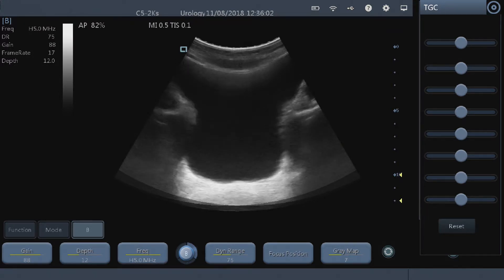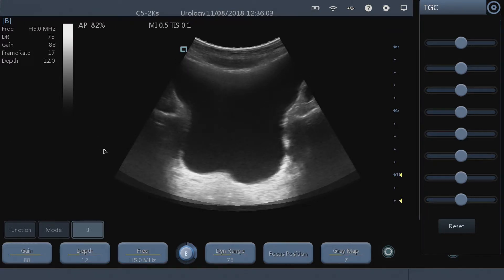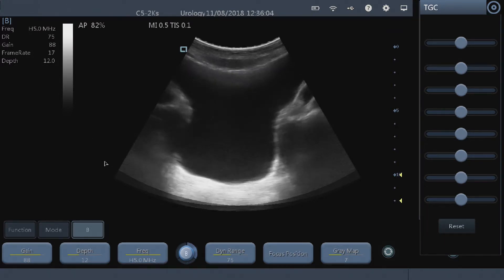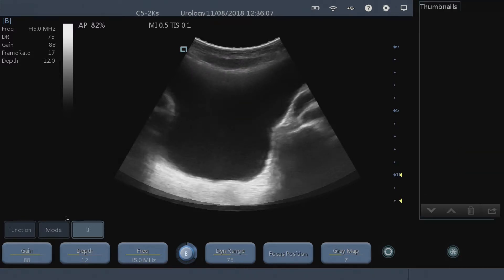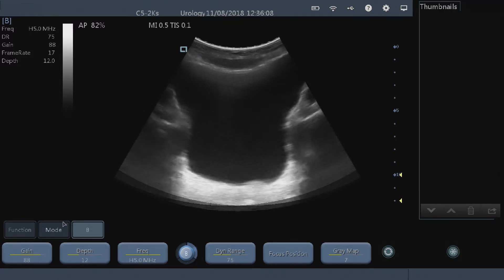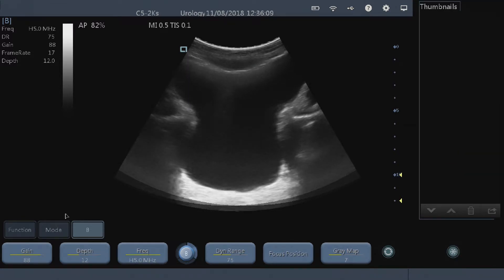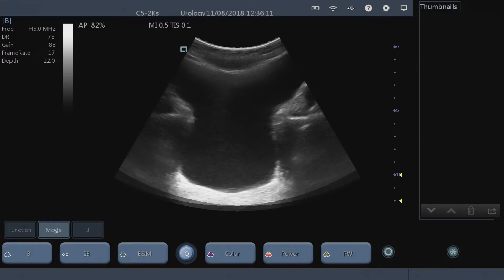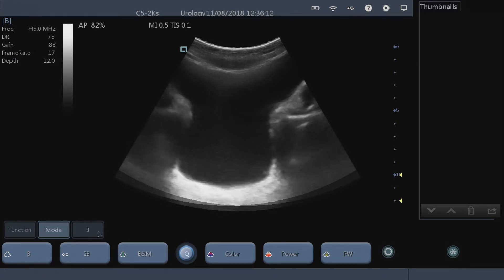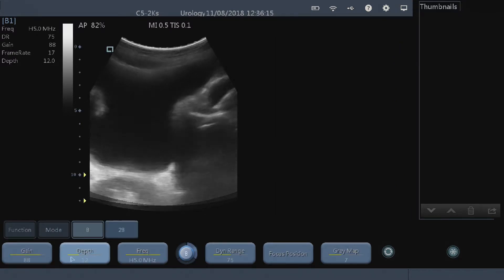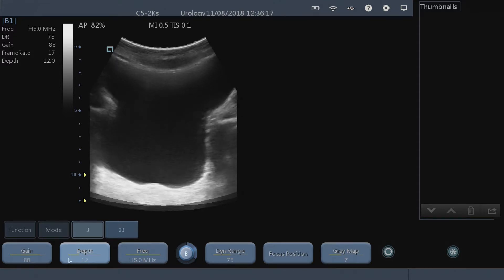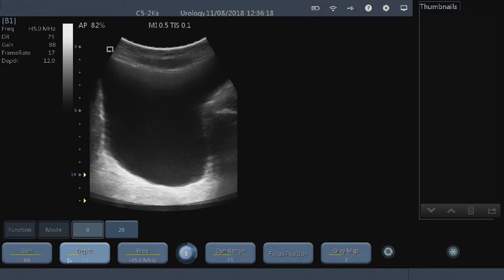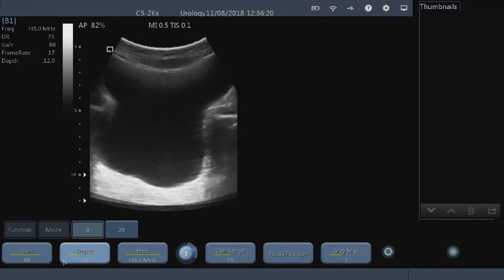First of all, we get an image of the bladder on the screen, which we have here. We're going to use the 2B mode before we do the measurements so we can get a transverse and a sagittal view of the bladder. Go to mode, hit 2B, and it's going to take a transverse view of the bladder on the left hand side of the screen.